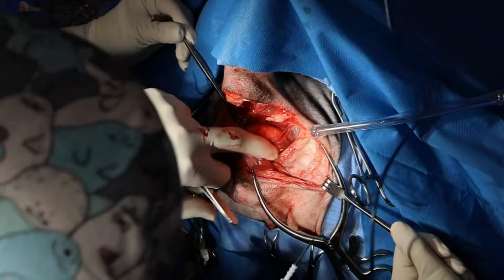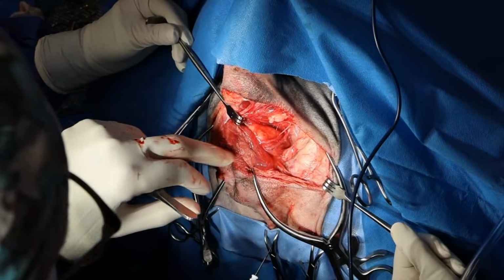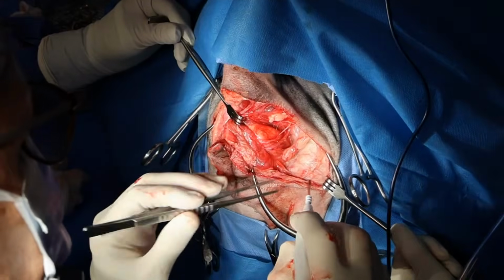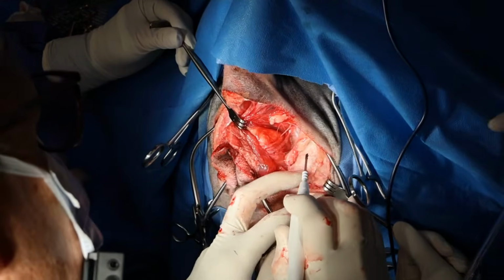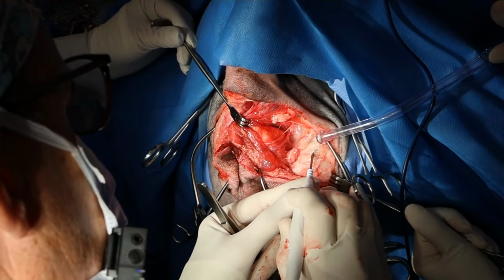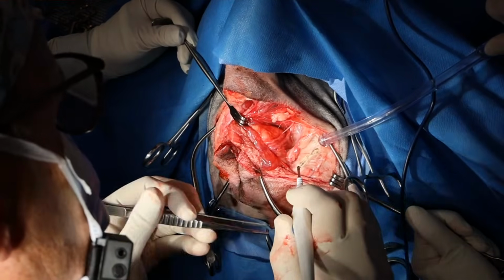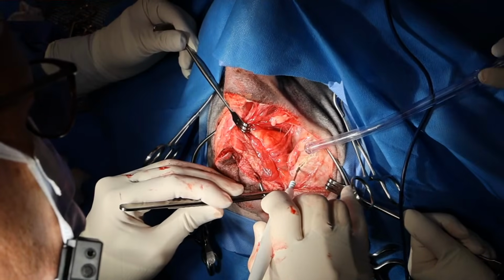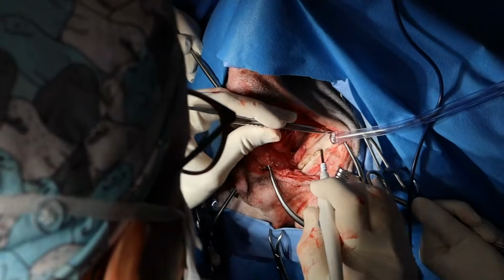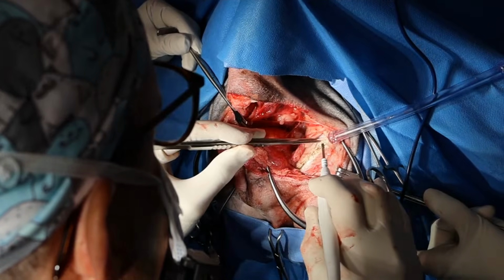Okay, so that's where the hernia is right there. Levator ani coccygeus complex, and our sphincter is right there. So the next thing that I'm going to do is, using my cautery, I'm going to just cut along that caudal edge and really try to preserve that tendinous attachment, because that's the really nice, thick, fibrous tissue, and that's what's going to really hold your suture.